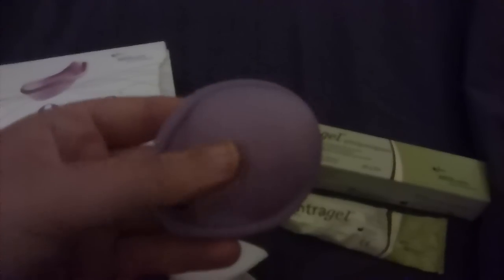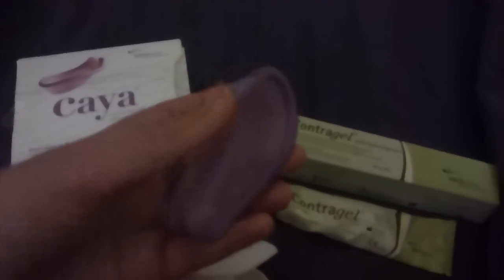Here is the Caya — it's a lovely lilac silicone. It is smaller in size than an Instead Softcup but larger in diameter than a menstrual cup, though it's nowhere near as deep.